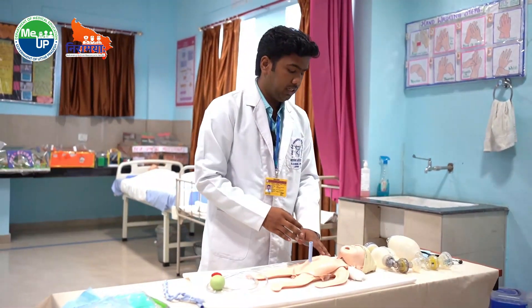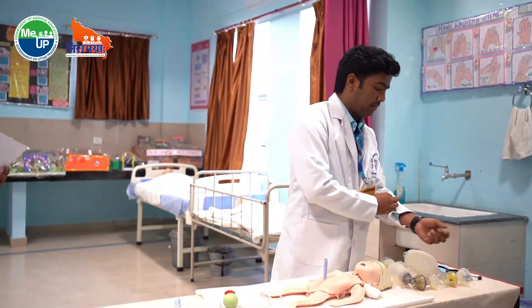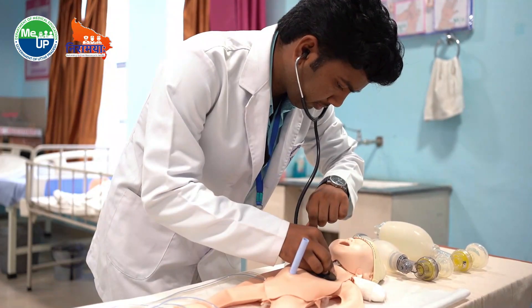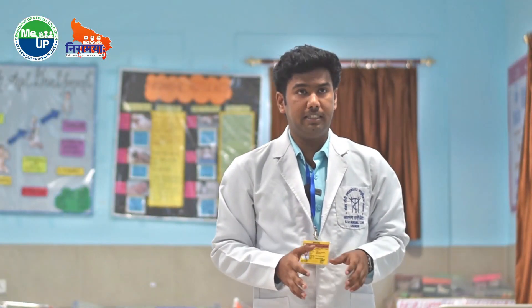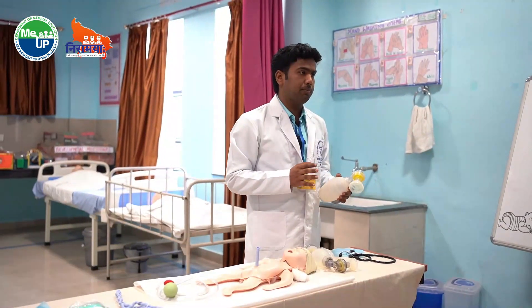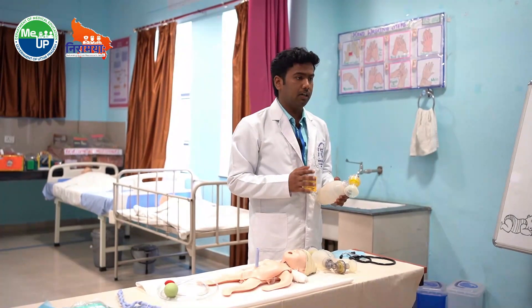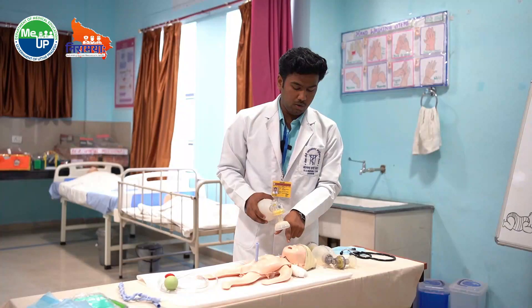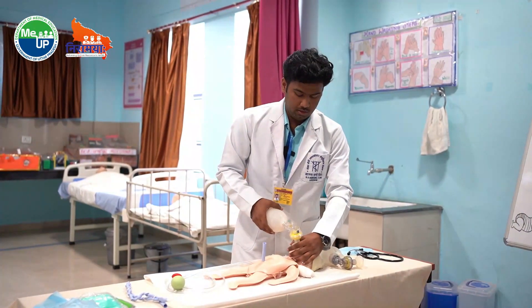After positioning, we will assess the heart rate and breathing for 6 seconds. After assessing, we will select the bag and mask of appropriate size. The size should be 0 for the preterm baby and 1 for the term baby. The mask should be placed such that it covers the mouth and the nose up to the chin.